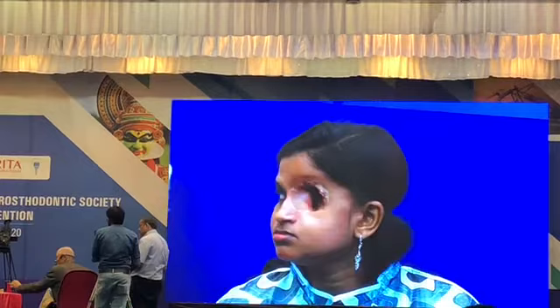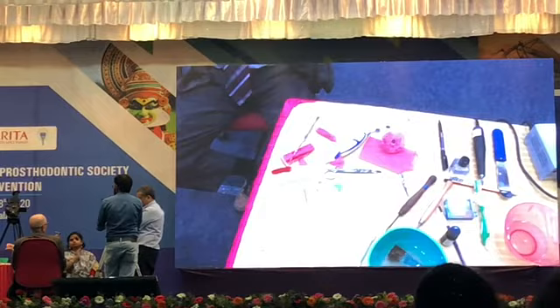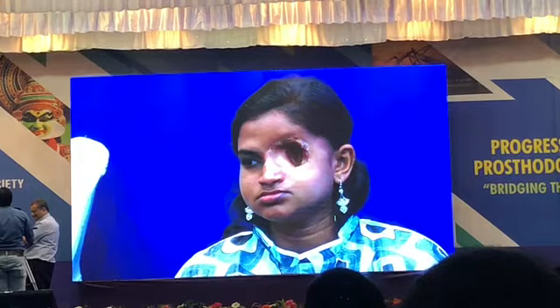Okay? So the way you do that, well, often I run into this problem when I'm in the clinic. So I always have a water bath. So I stick the wax in the water bath and get it so it's molten a little bit, and then you can move the globe around without messing up your sculpture. But with this, it's almost impossible. So let me see what I can do here.